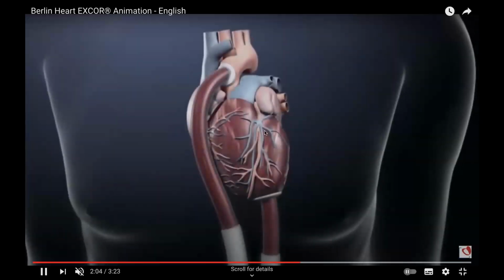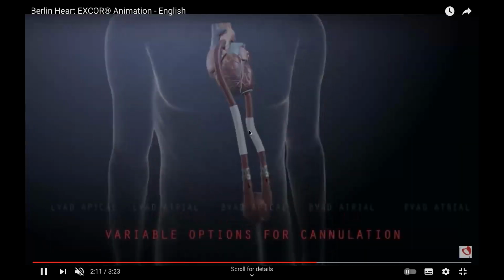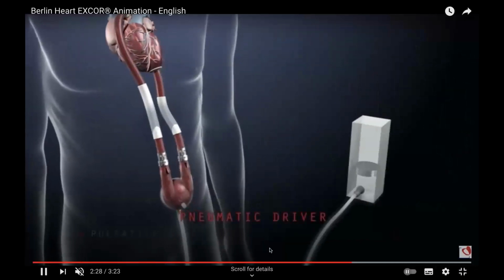So just looking at how it works, this is the heart. The cannula is attached to the apex of the heart, or the tip of the heart. Blood comes out, and then it can be pushed back into the different sides of the heart. This image here tells you various cannula strategies. It can sometimes be cannulated between the top chambers of the heart or the bottom chambers of the heart. That is what this slide is telling you, that there are various ways and places to put these cannulae.